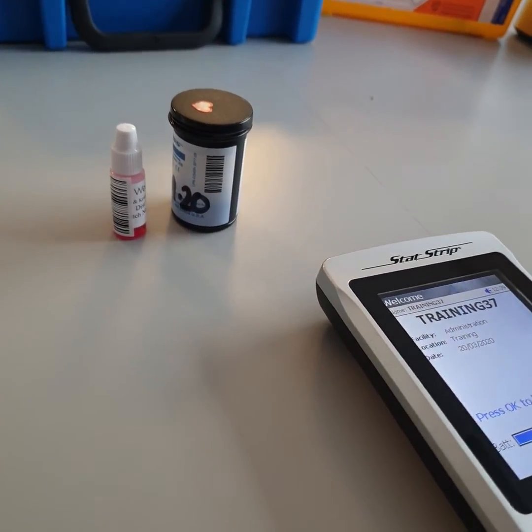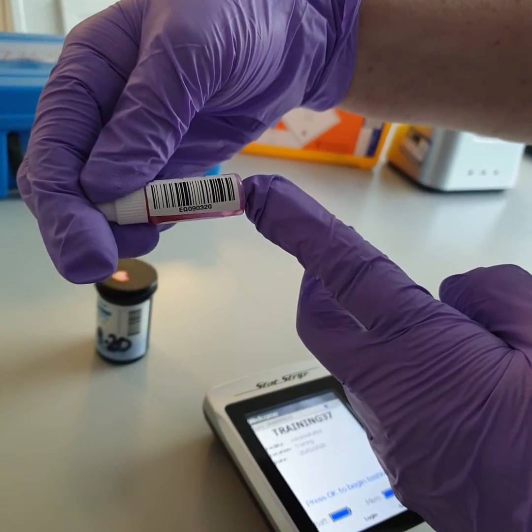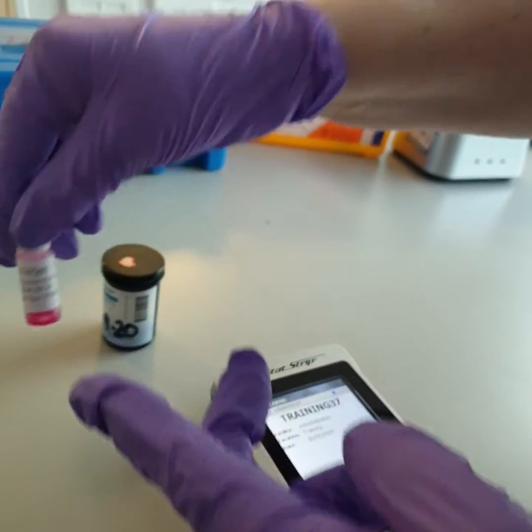The sample looks like this. It has a barcode that resembles a patient sample, so it should be tested like a patient sample.